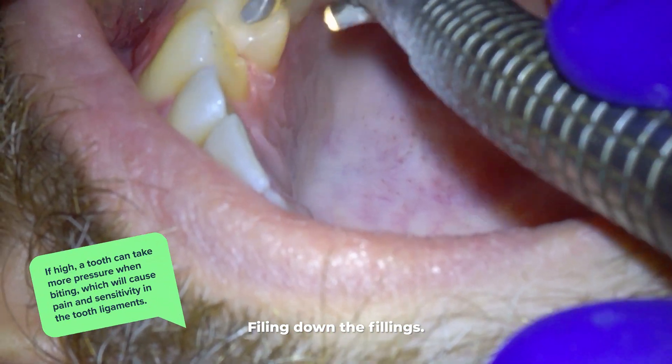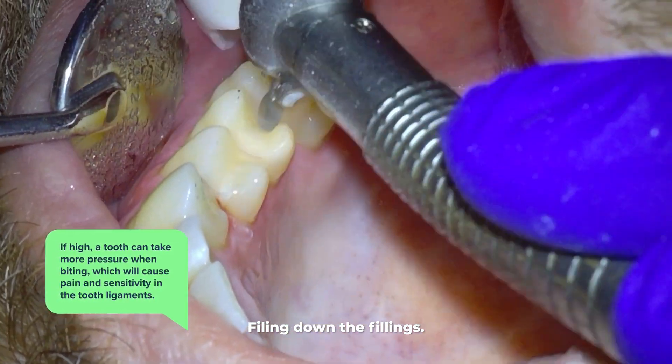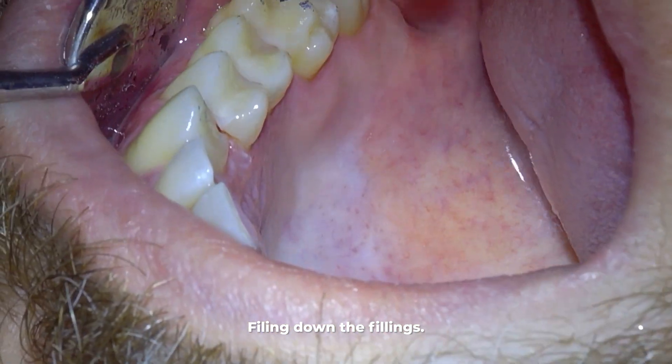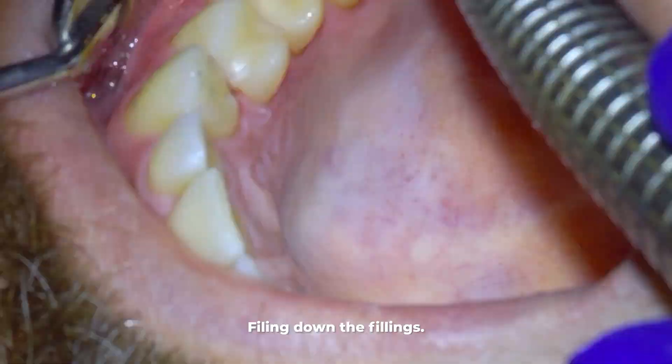If the filling is at all high, it can throw off a patient's bite and have a lot of bad consequences, including pain. Also, if a filling is too high, that tooth will take more pressure when biting, which causes pain and sensitivity in the tooth ligaments.